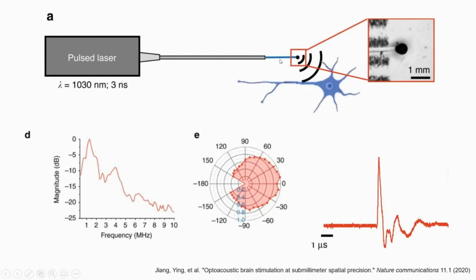The idea would be that if you put this really, really little probe, you can see the scale here is 1 millimeter, directly next to your neurons, or implant this fiber somewhere in the brain, then you can do local stimulation of these cells. I'm really excited to see this implemented in freely behaving animals. In this paper, it's only done in anesthetized fixed animals. Here you can see the ultrasound pressure wave.